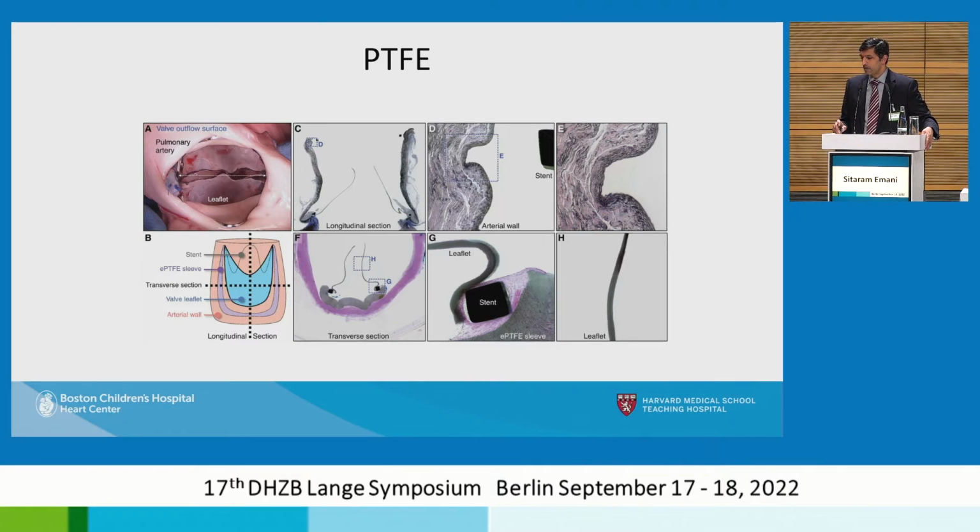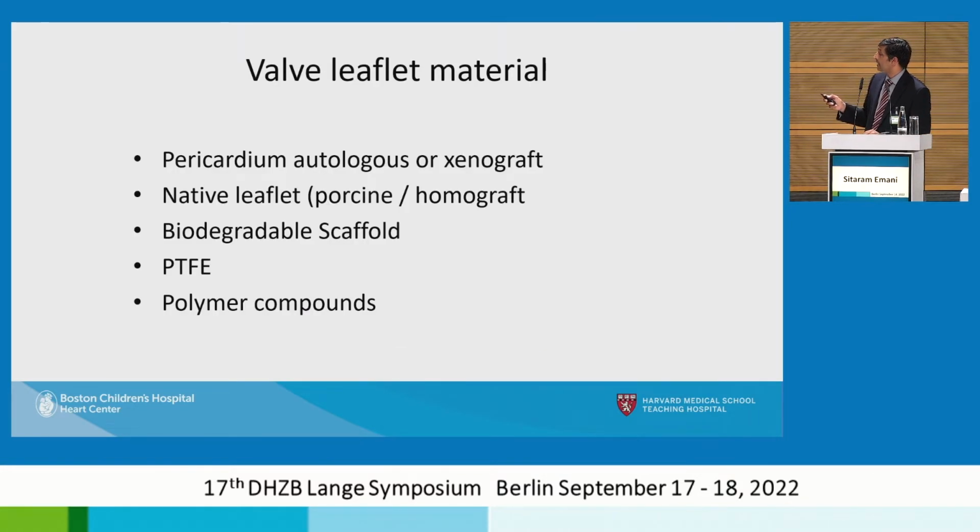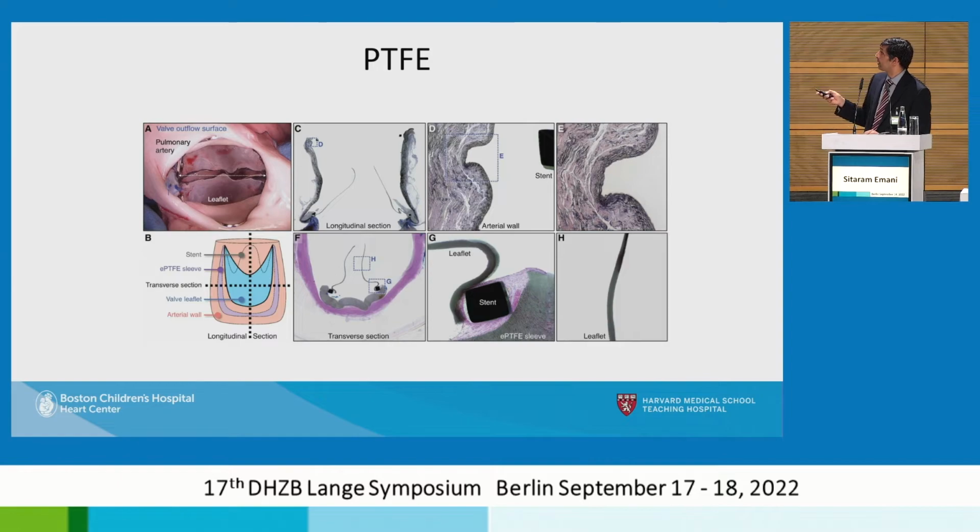And one of the first concerns was the development of thrombus within a foreign material. But what was interesting is that the location of thrombus tends to be in areas with less turbulent flow, and typically at the base of the leaflet. So here you can see a valve design, and this is the external housing, and this is a PTFE leaflet. And right at the base of that leaflet, down at the corner, you can see a small clot that has formed.